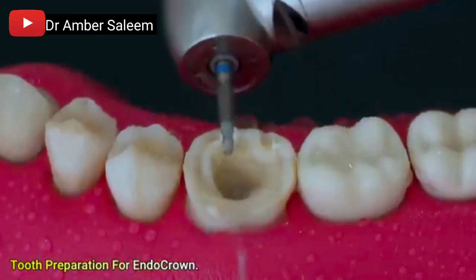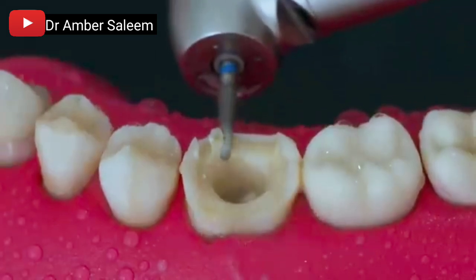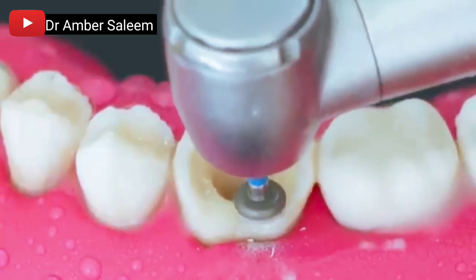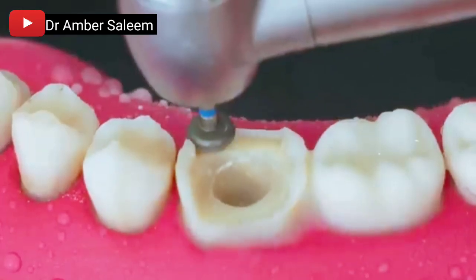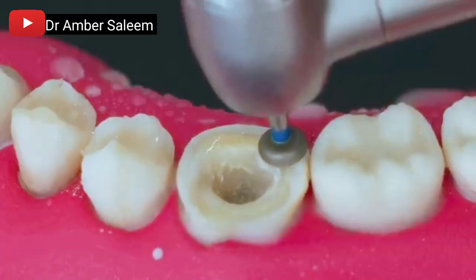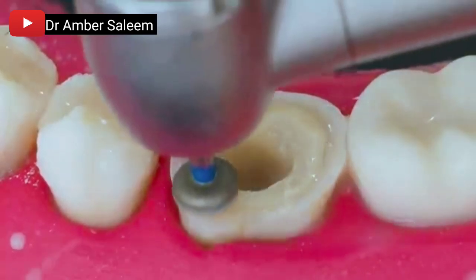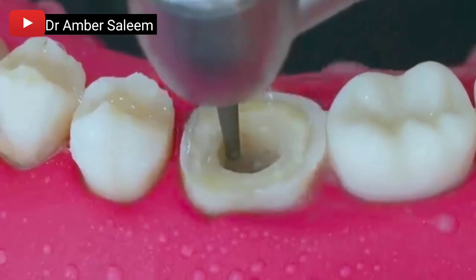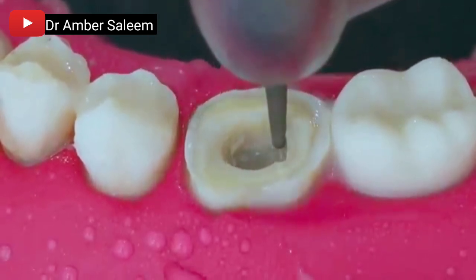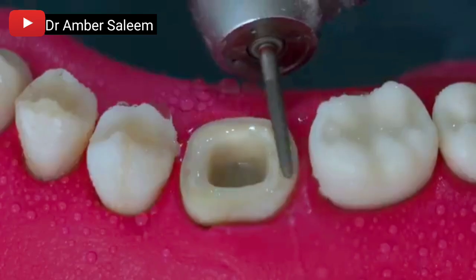Preparing for the endocrown restoration. The tooth is prepared to receive an endocrown, a single-piece ceramic restoration that engages the pulp chamber for retention.